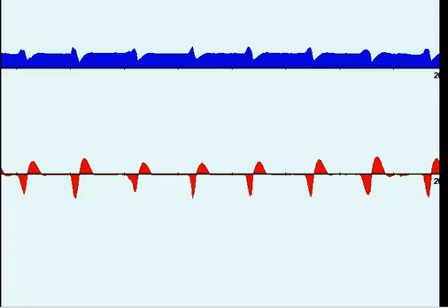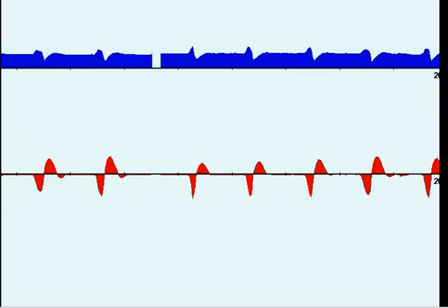Here's an example of CPAP, the most common form of continuous spontaneous breathing. So with CPAP, pure CSV, all breaths are spontaneous, however, they're not assisted. So the patient can set their own breathing pattern, rate.